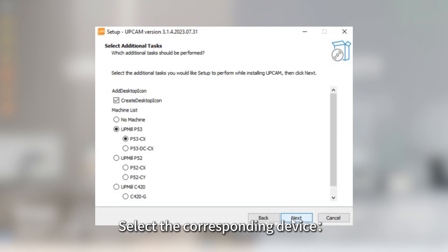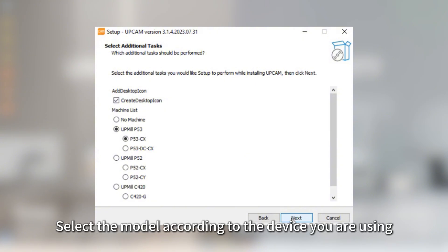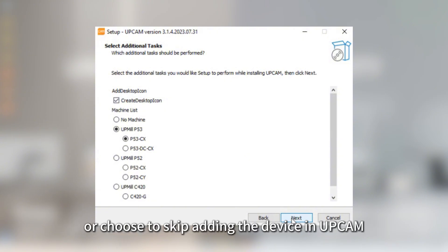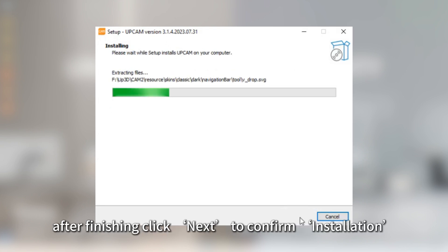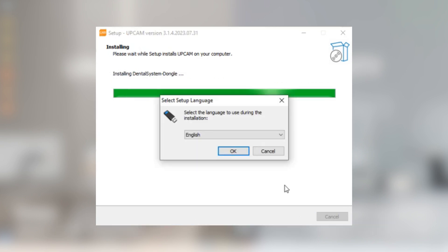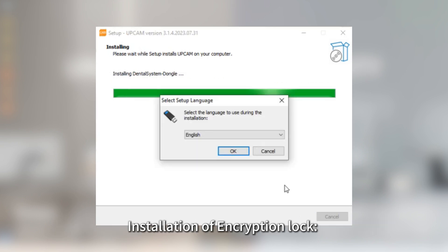Select the corresponding device. Select the model according to the device you are using, or choose to skip adding the device in UPCAM after the installation is completed. After finishing, click Next to confirm installation.